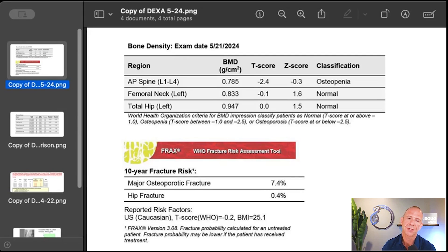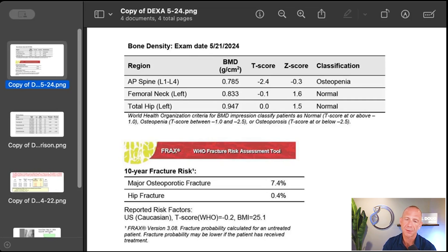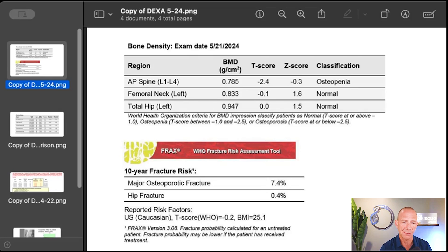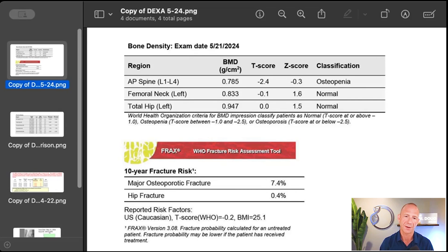People often ask why the hip and spine scores are so different. Osteoporosis is generally a full-body disease, so you'd expect them to be closer — unless you're loading one part differently than the other. This patient actually has spine issues, so she's likely not loading her spine as much as her hips, which could make this real. You also see FRAX here — an online calculator for 10-year major osteoporotic fracture risk and hip fracture risk. Her scores are relatively low, though a spine score of negative 2.4 gives a 10-year risk of 7.4%, which isn't that low.